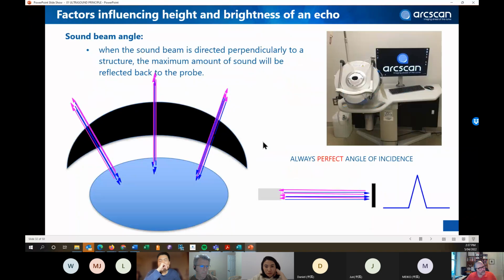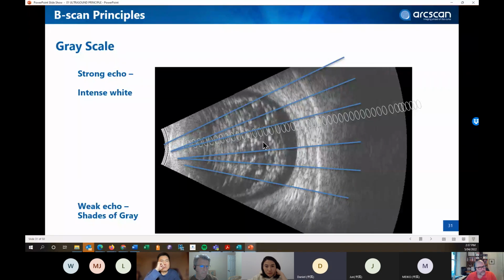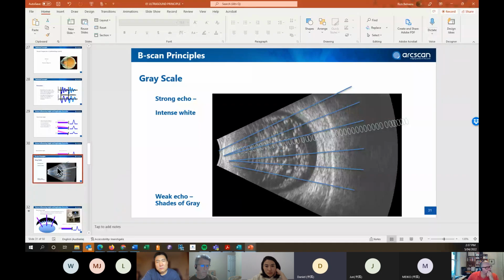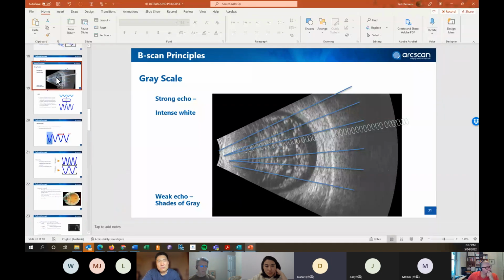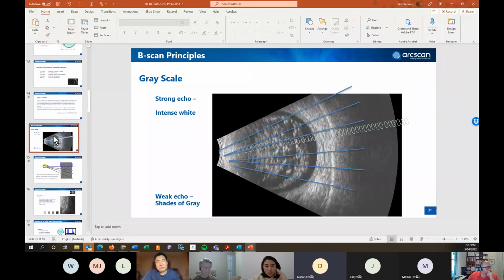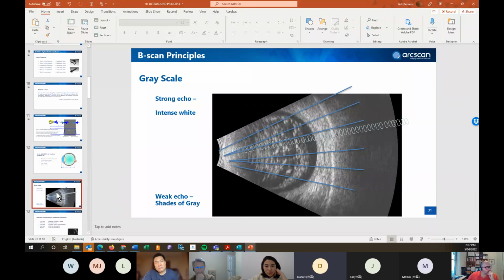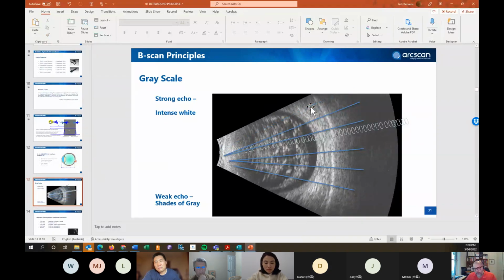Okay. Yeah, I know. My question is, do we have both the arc orbit and the linear orbit? Because, you know, different patients have different coverage, can we adjust the coverage among different patients? No, because our probe moves on a curve that is already arced.